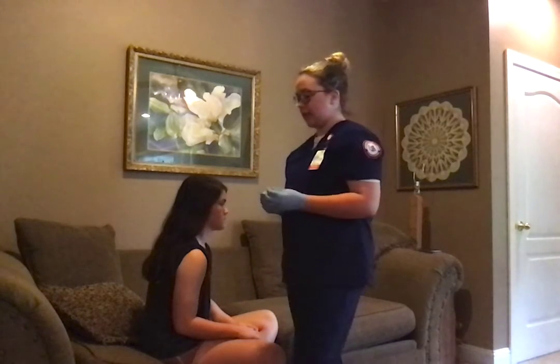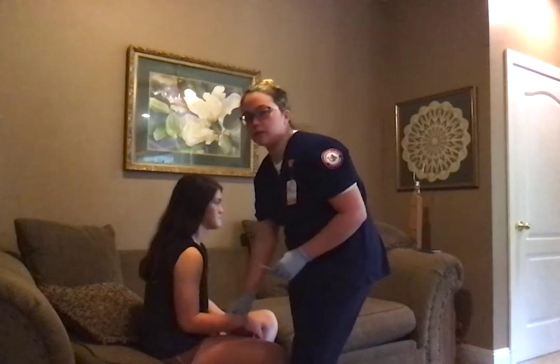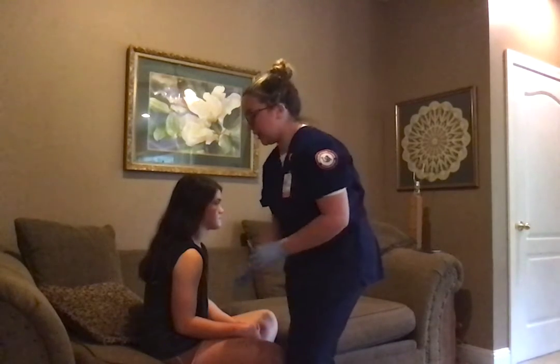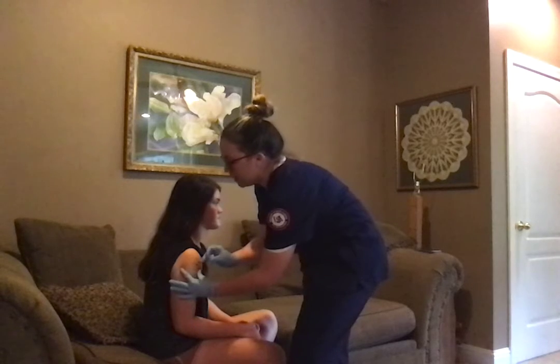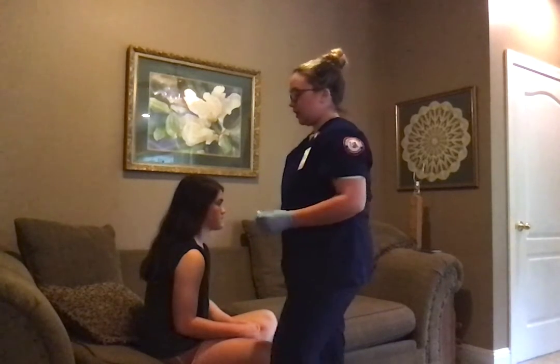So this is an intramuscular injection site. So I would make sure that my patient's arm was relaxed, and then I would inject here at a 90-degree angle for intramuscular.